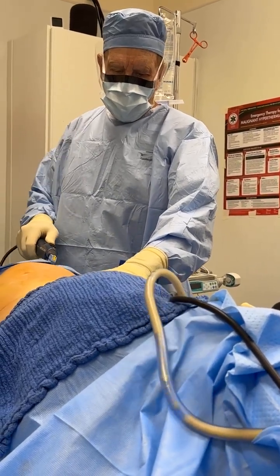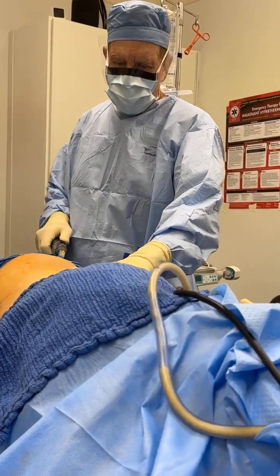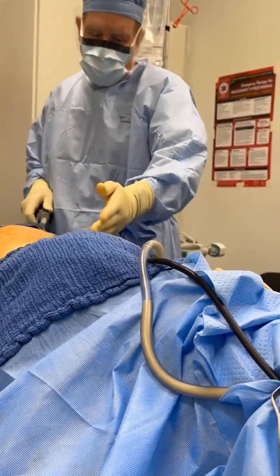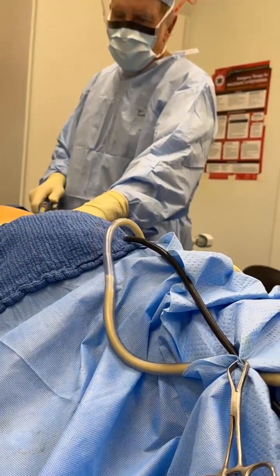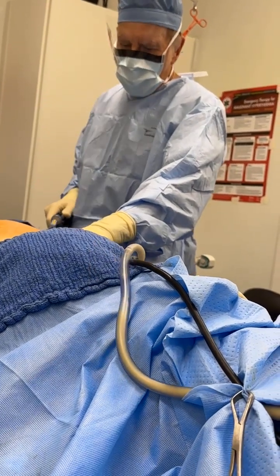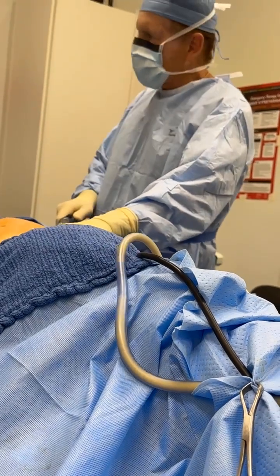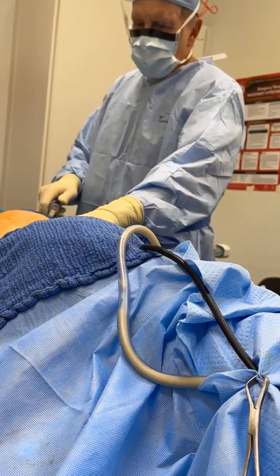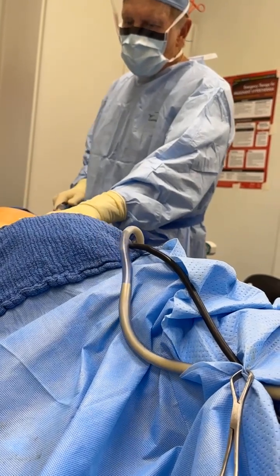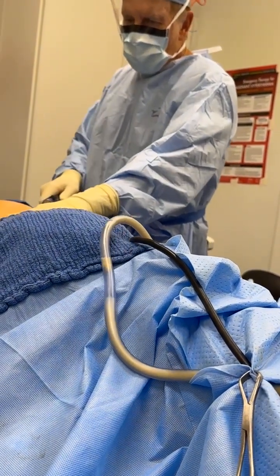You'll see that the very yellow fat we get here is what's going to go into her buttocks — yellow fat, not red. As a result, fat graft retention is greater, because you're putting yellow fat. You're not putting blood into it. If you put blood into the buttocks, that blood is going to resorb, and then the buttocks are going to be smaller. This is the way we do it here at the clinic.